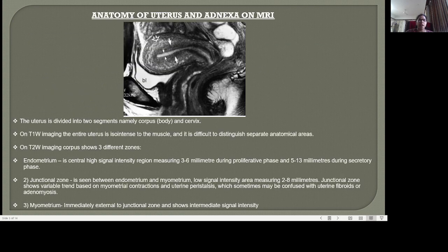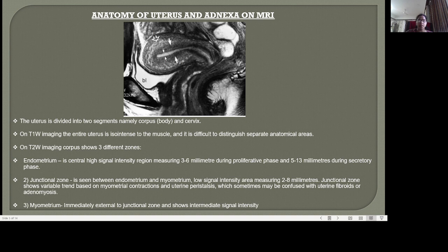Coming to the MRI anatomy of the uterus, the uterus is divided into two segments: the corpus and the cervix. On T1 weighted imaging, the entire uterus is isointense to muscle and it is difficult to distinguish separate anatomical areas. On T2 weighted imaging, the corpus shows three different zones. The endometrium is a central high signal intensity region measuring 3 to 6 mm during the proliferative phase and 5 to 13 mm during the secretory phase. The junctional zone is seen between the endometrium and myometrium as a low signal intensity area measuring 2 to 8 mm, showing variable appearance based on myometrial contractions and uterine peristalsis, which may sometimes be confused with uterine fibroids or adenomyosis. The myometrium is external to the junctional zone and shows intermediate signal intensity.